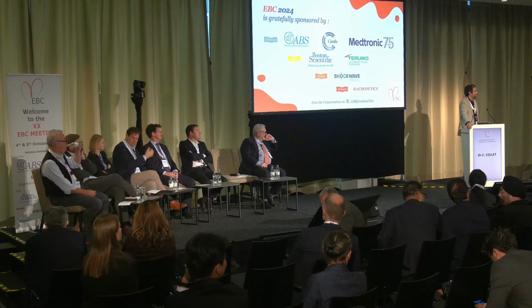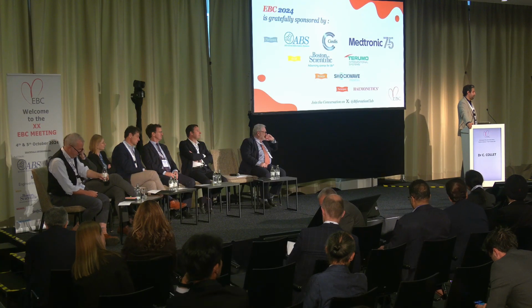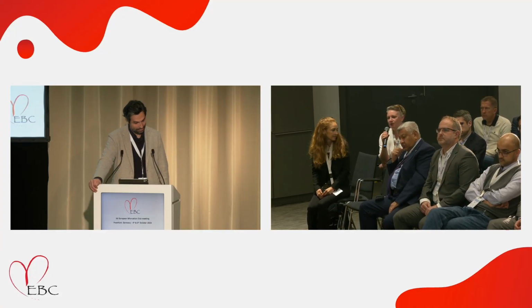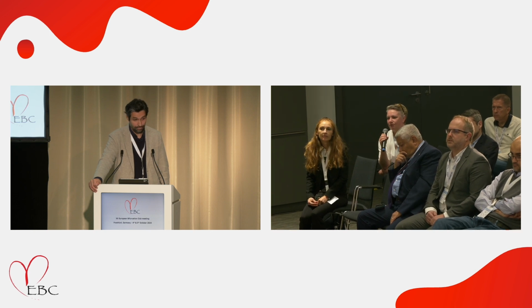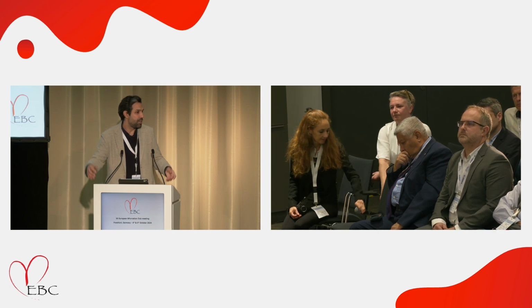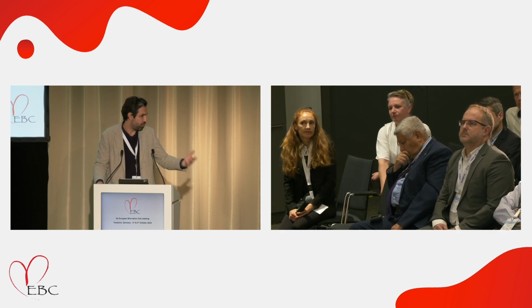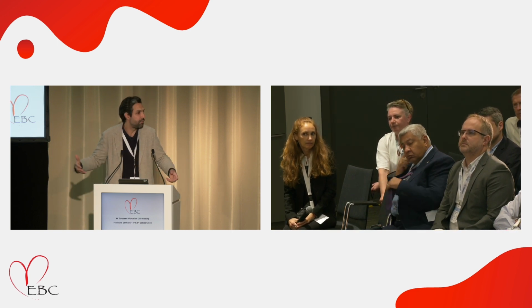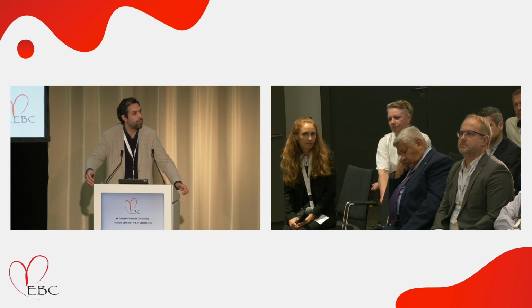I think that you sort of asked my question about IVUS, and you also answered it. So what is the percentage of the cases where you plan with the CT, but you find something different, it goes differently, and then you rely on your IVUS and FFR? Because you also have to check what your result is post-procedure. Yeah, so intravascular imaging, as I said, pre-PCI is pretty much solved with these pictures, but after you place a stent, you will need intravascular imaging either to assess the effects of modification or the placement of the stent. So it becomes more of a checking tool at the end.